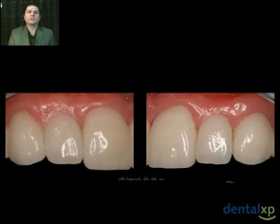Because we have ceramic against ceramic, we lack the challenges that we find when we have dissimilar materials next to each other. One of the challenges of having dissimilar materials, for instance, a ceramic restoration against a porcelain fused to metal restoration, is a phenomenon called metamerism, where under different lighting conditions you have a different optical effect from the restoration. You can actually discern the difference between the two restorations, and obviously that's not what our objective is. Our objective is to have it indiscernible.